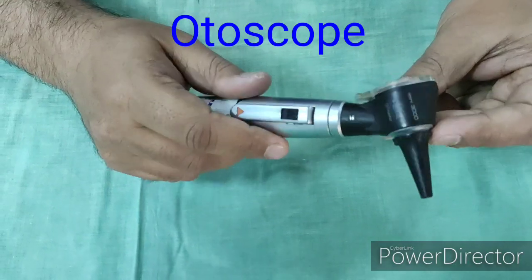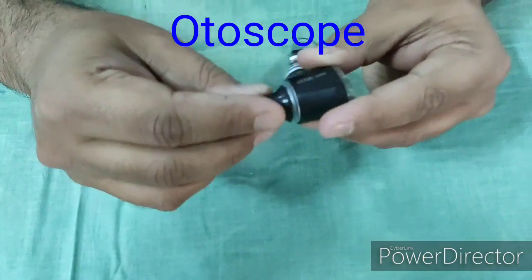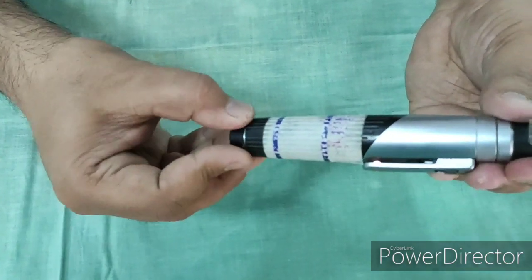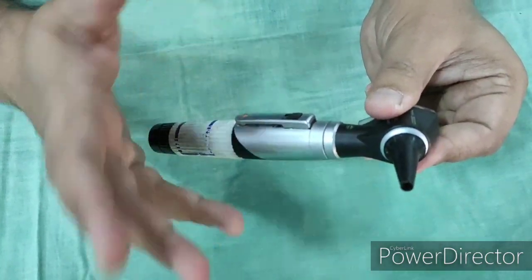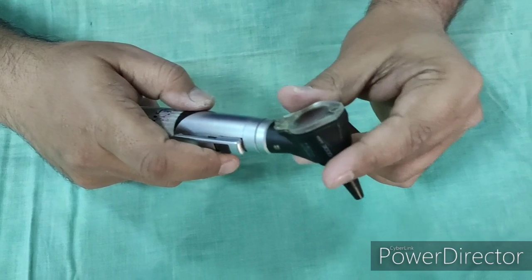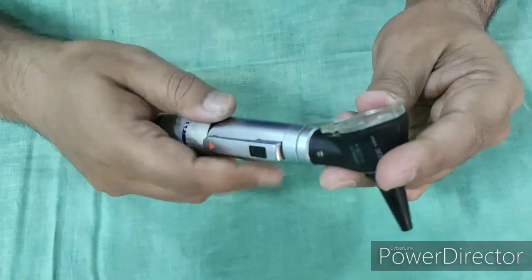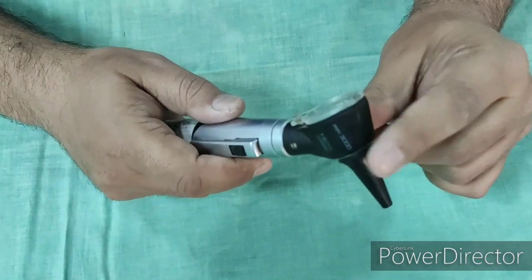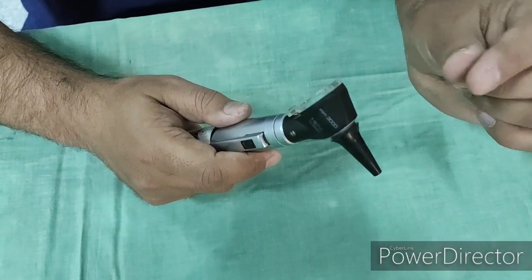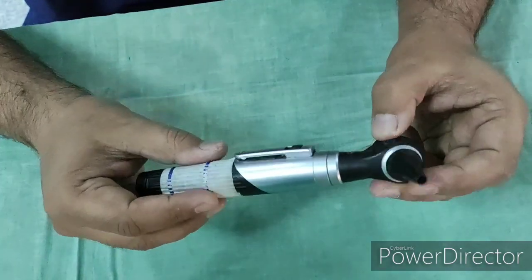This is a handheld battery-driven otoscope. The speculum is attached here and the lens is a convex lens; the battery is put inside and it gives a magnification of around 2 to 3 times. It is used for examination of the tympanic membrane and the ear canal; the middle ear can also be seen through an otoscope if there is a perforation. The pinna should be pulled upwards, backwards, and laterally so that we are able to see the tympanic membrane, because the external auditory canal is tortuous — pulling the pinna straightens it.